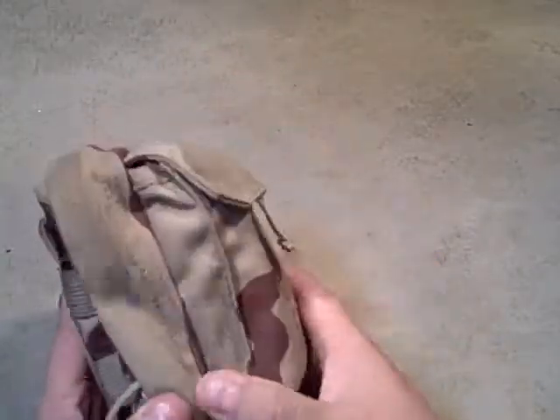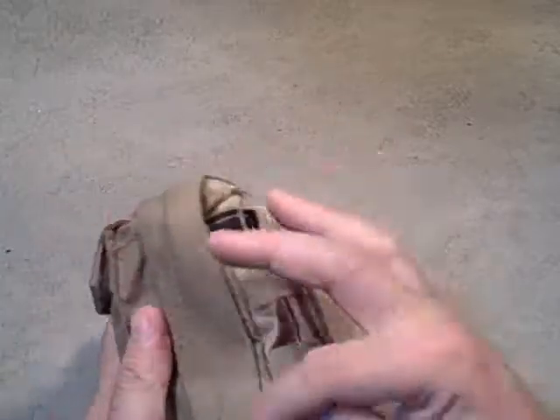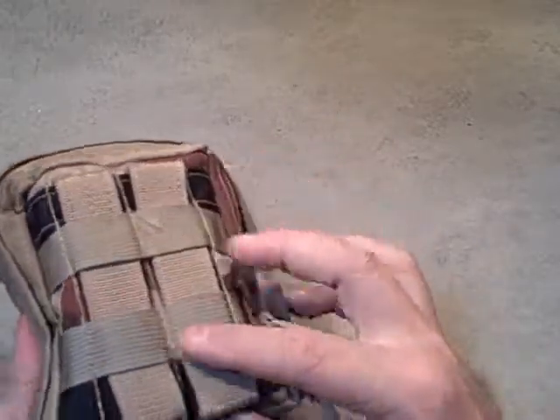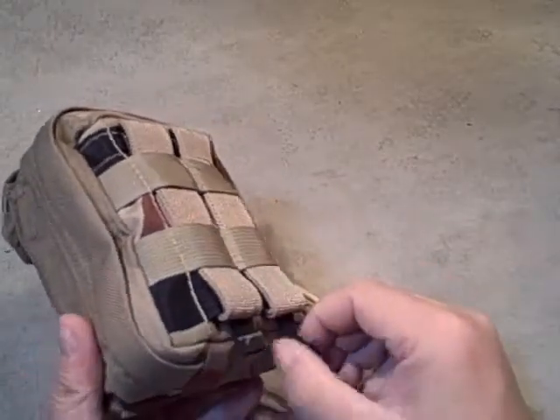Taking a look at the outside, it's in the three-color desert camo. We've got a smaller outside pocket retained with Velcro, and then a zippered inside pocket. It's MOLLE compatible with a proprietary PALS system called the TAC-FIT.